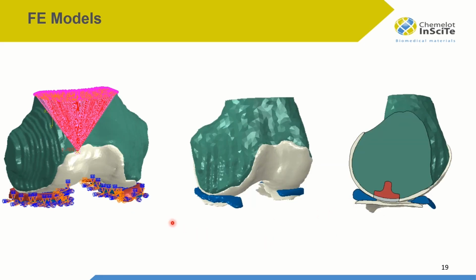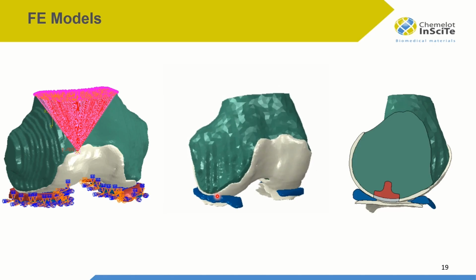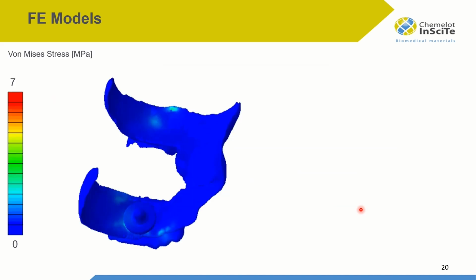As a result of the boundary conditions, we observe the following motion in the joint, and here you can also see the implant. In a side view of this motion, we can also see the locations where the implant is articulating against the opposing cartilage or the meniscus.